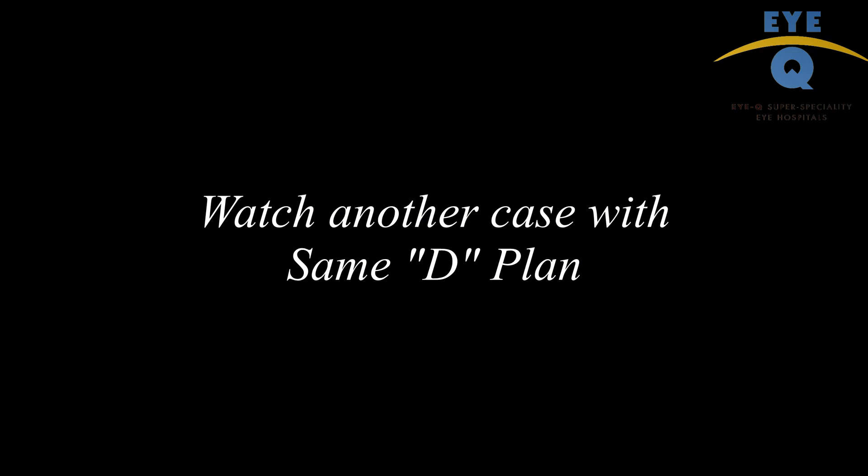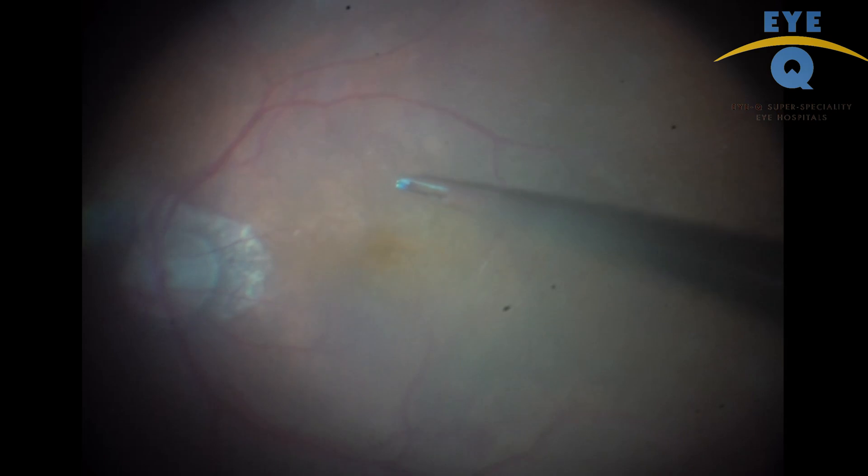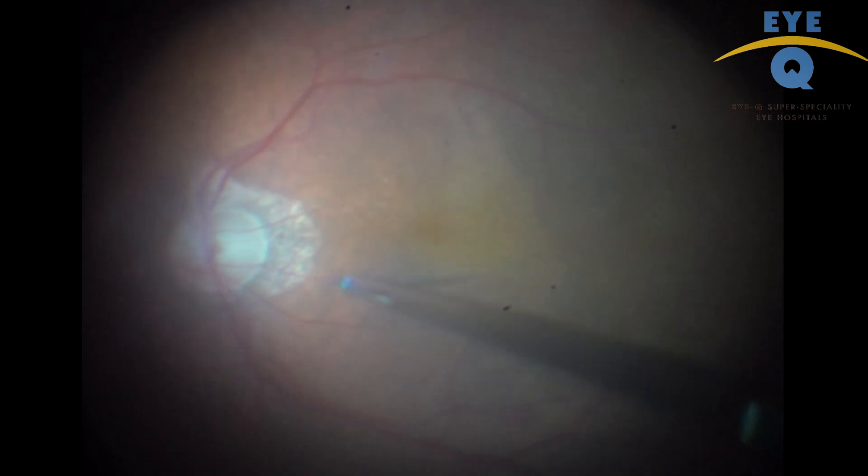Now this is another video showing a long peel in the same D format for a case with ERM. You can note that both ERM and ILM are peeled together.